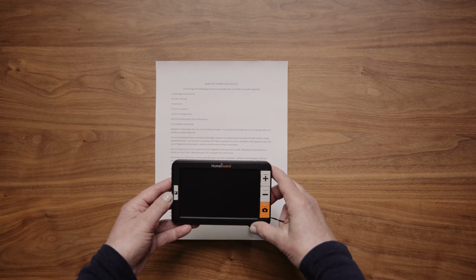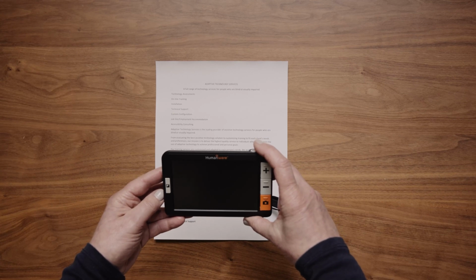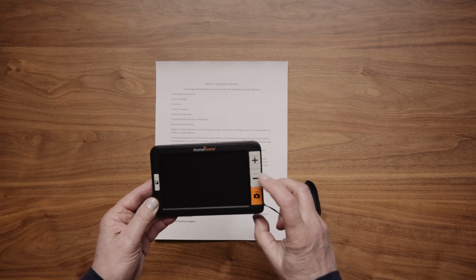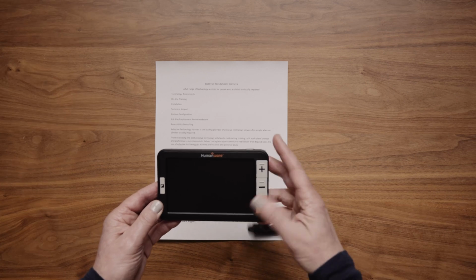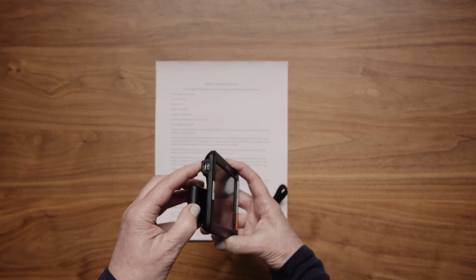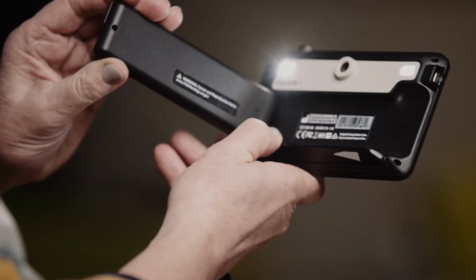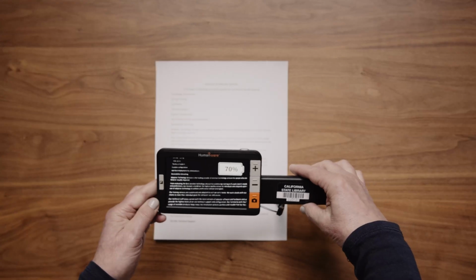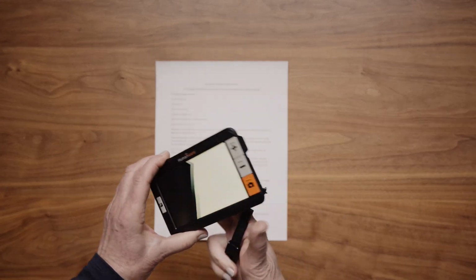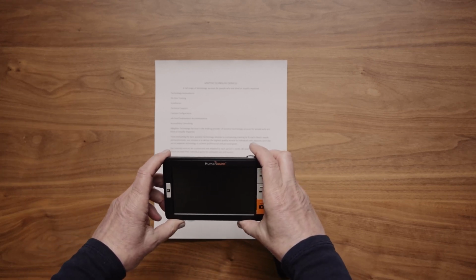Using the handle. 1. Hold the Explore 5 with the screen facing you. Contrast button on the left, zoom in plus, zoom out minus, and freeze buttons on the right. 2. Feel a gap on the lower left back side of the device. 3. Place your finger in the gap, open, and flip the handle to the right. 4. Close the handle to turn off the Explore 5. To turn on the device again, either open the handle or press and hold the power button.